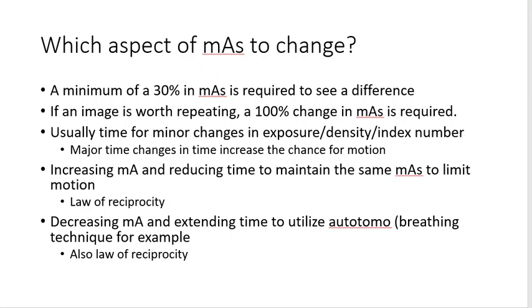So if you need to repeat because you underexposed the patient, then you need to double your mAs. If you need to repeat because you overexposed the patient, you need to cut your mAs in half.